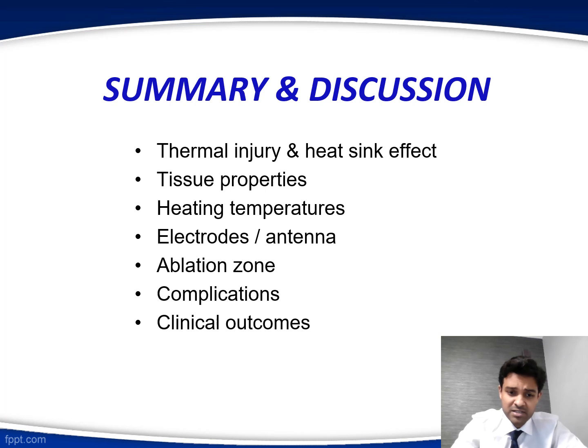The various complications are almost the same for both RFA and microwave. And the clinical outcomes, how effective is RFA, how effective is microwave, how effective is cryoablation, and endometrial ablation is safe and less invasive.